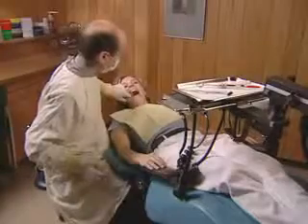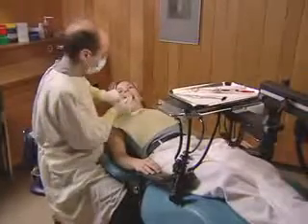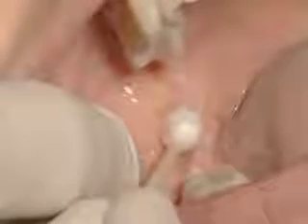When administering a local anesthetic, it's important to make sure that your patient is lying in a supine position in order to reduce the likelihood of syncope. Patients about to receive an intraoral injection are often anxious, and if they're sitting upright, there's a chance they'll faint. Topical anesthetic may be placed prior to any injection. It should remove the initial sensation of needle penetration and therefore may be of value. If used, you should allow a few minutes for onset of action. The sensation of needle penetration is also reduced by the retraction of soft tissue such that the mucosa is taut.